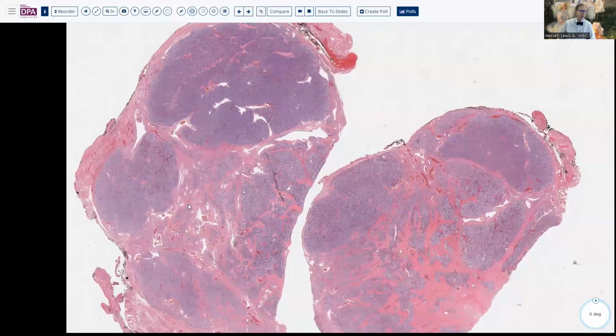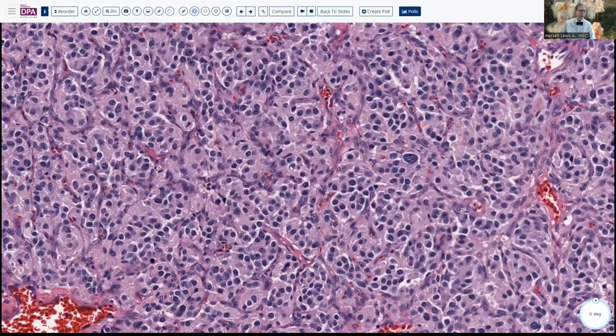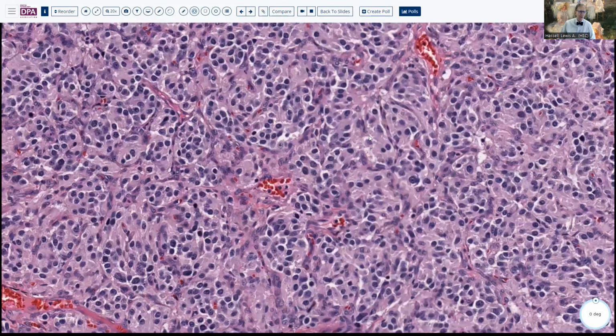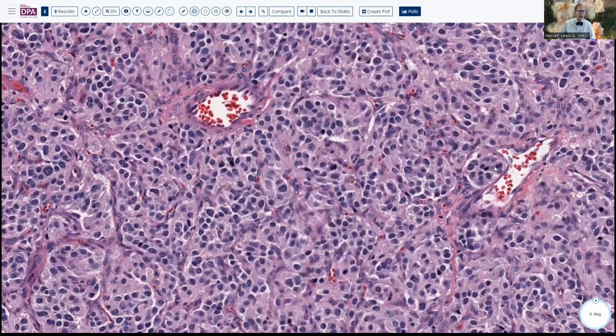Additionally, this lesion has a lot of that same lobulated appearance, very vascular, some larger vessels. But I think as you come into higher magnification here, you begin to appreciate the small packeting of these cells, and that there may actually be kind of a degree of pleomorphism that's present here, as well as here you see these balls of cells, as it were, the infamous Zellballen of a paraganglioma, which again can be very vascular, but don't have quite that same vascular myogenic appearance that we see with the glomus tumor.